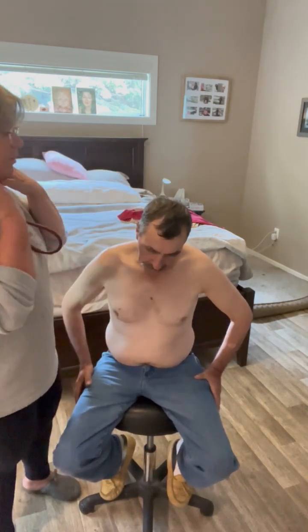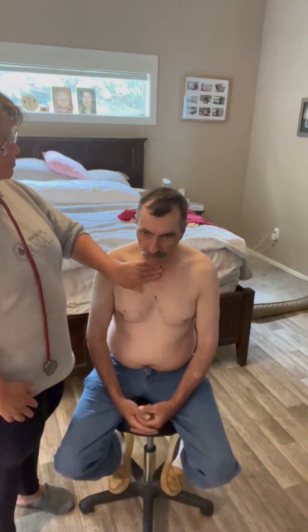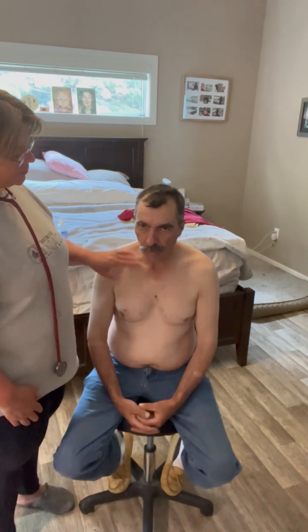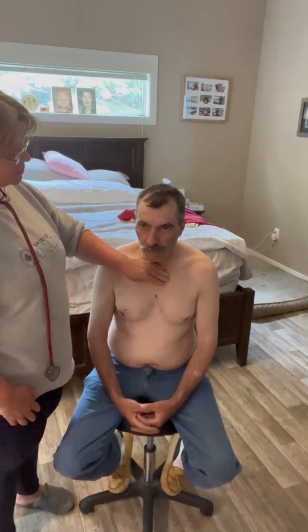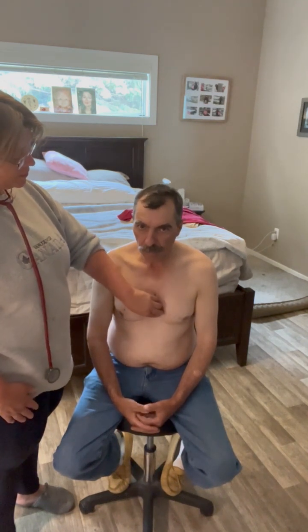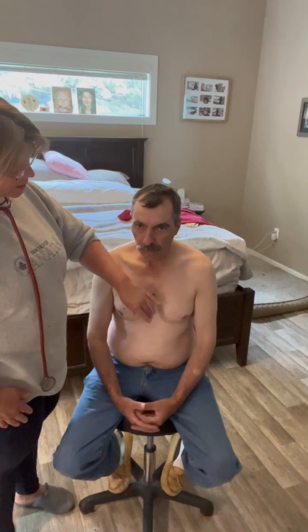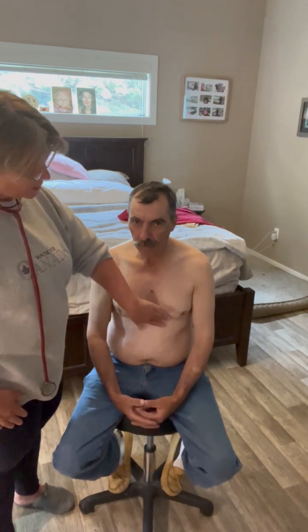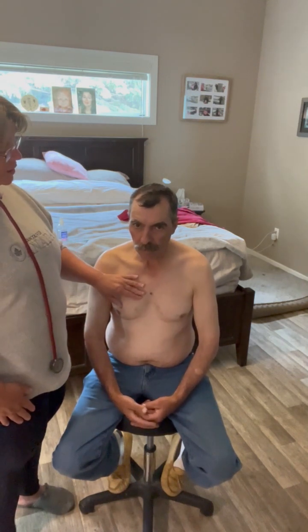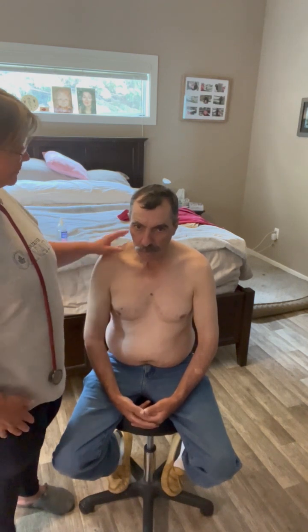Good. Thank you very much. You can breathe normally. So when I listen to his lungs, I hear tracheal breath sounds over top of his trachea, vesicular breath sounds up in the apices, bronchial breath sounds right above his bronchi, bronchovesicular in between the two, and the vesicular breath sounds in the lower lung fields as well. He's got good air entry throughout and certainly clear all the way to the bases.